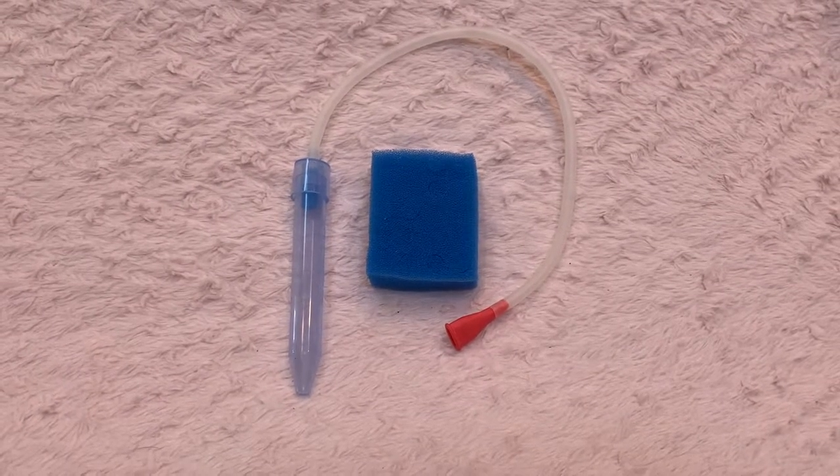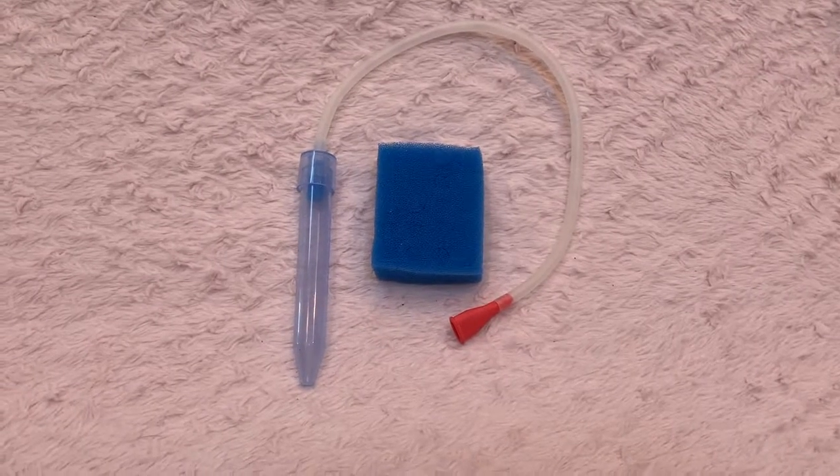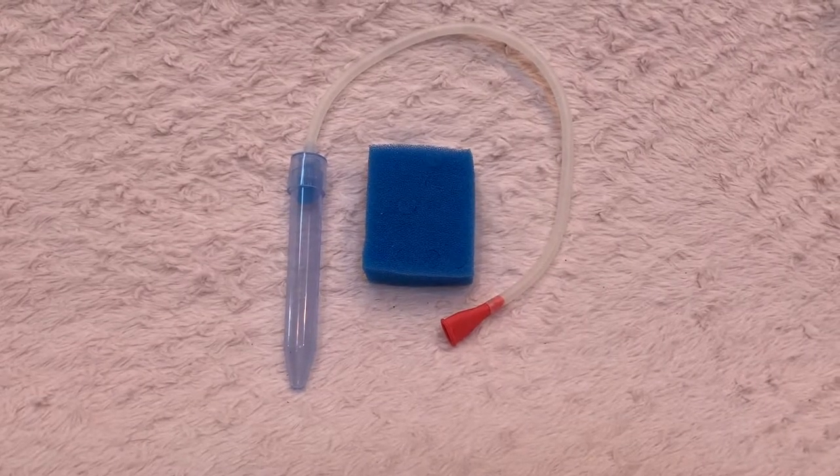Hi everyone, today I'm going to do a review on the NoseFrida. I'm first going to go over the product itself and then talk about my opinion and experience with it.